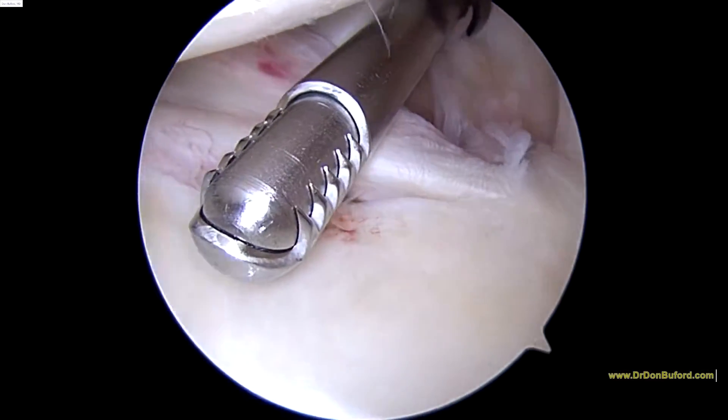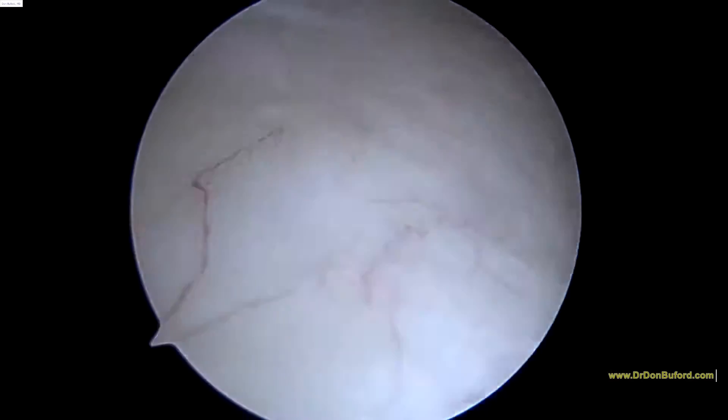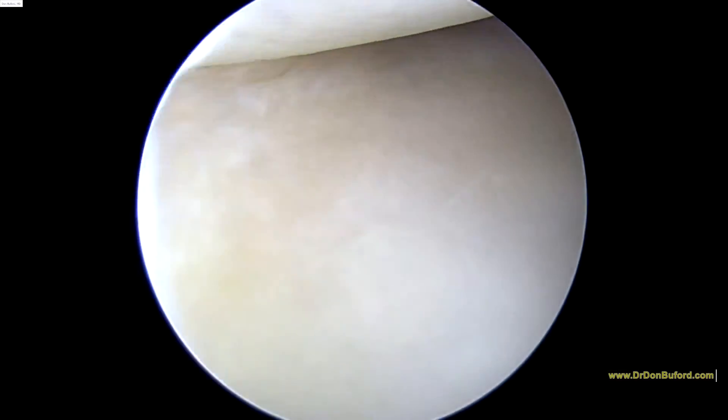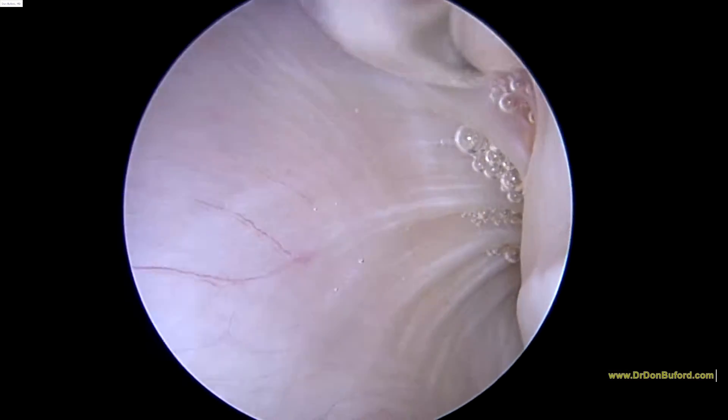We're going to rotate and look towards the back of the shoulder here. As we push down and look back here, the posterior glenoid has a little bit of soft tissue on our face — don't mind that. The posterior glenoid and labrum look fine. The posterior capsule looks good.